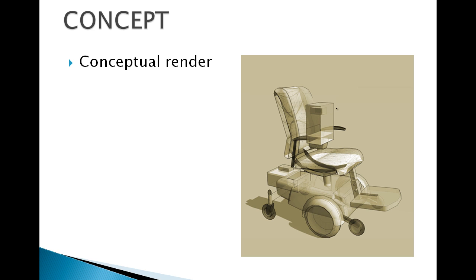Over here on the right palm rest is the position capture block, so the patient can sit in the wheelchair and his hand would rest on a surface here, and there would be illumination coming up from underneath, and a camera positioned above it would be able to capture a silhouette of his hand and send it to a processing system.